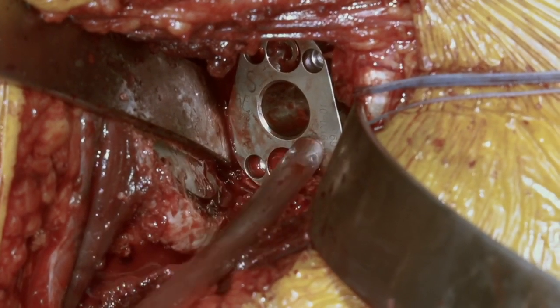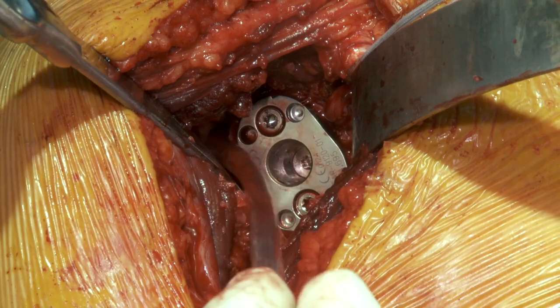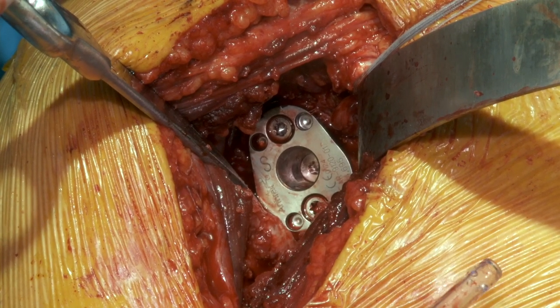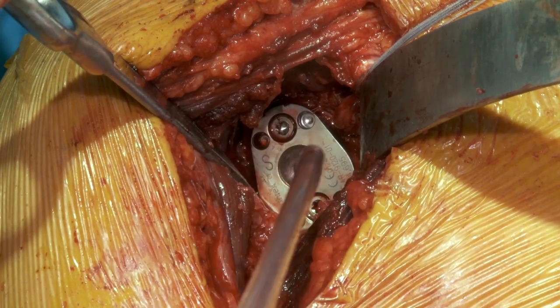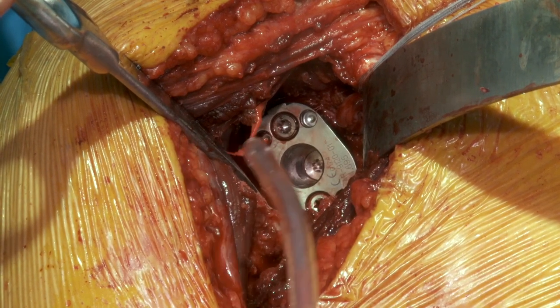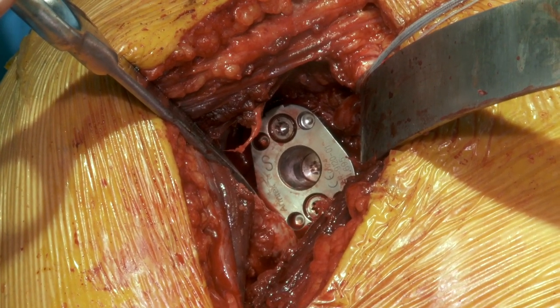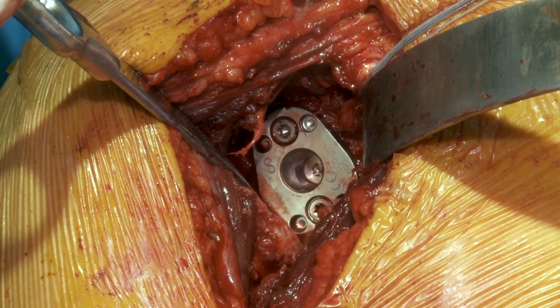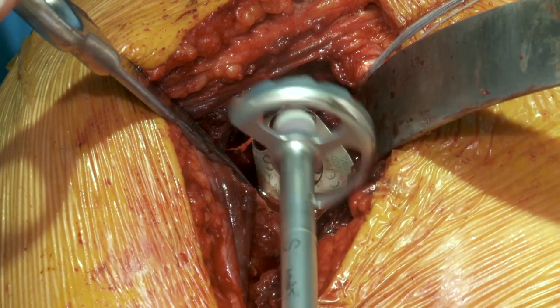It's a small patient, so we're going to use the 36 glenosphere. We could use the standard 36 medialized glenosphere if we were doing more of the Grammont style, but my preference is to use the 36 lateral offset plus 4 as our glenosphere. This puts the center of rotation in a more anatomic position and balances out not only the remaining rotator cuff but the other soft tissues around the shoulder, including the deltoid, in a much more anatomic position. With a lateral offset on the glenosphere, even if you don't have good-quality rotator cuff, you can improve the patient's external rotation after surgery — so it's definitely my preference.